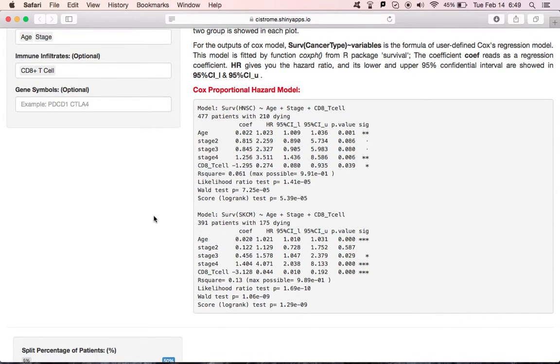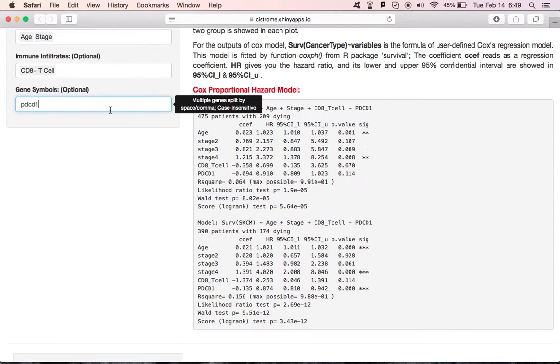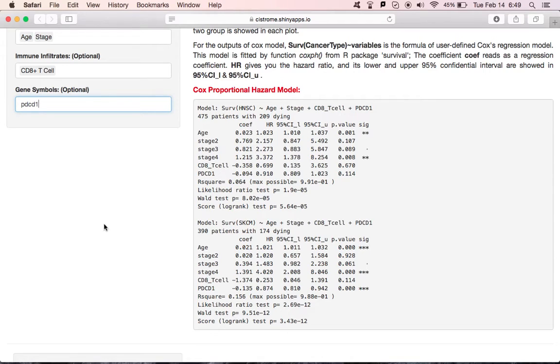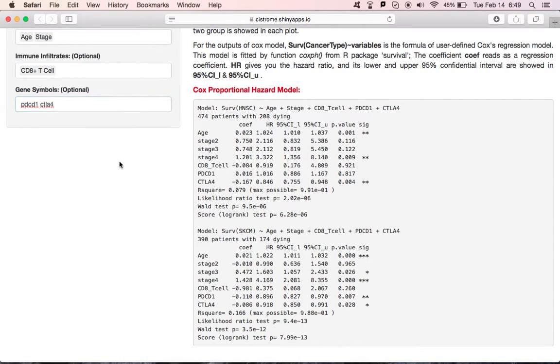Users are also able to include a list of gene expression values into the Cox Model. If you input PDCD1, as well as CTLA4, you will get those genes added into the model as well.